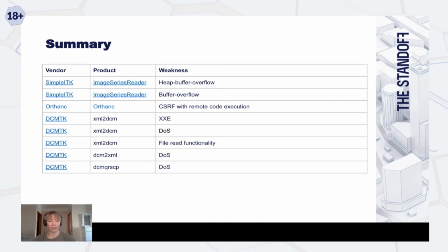And in the end of my presentation, I would like to make a summary. I would like to say that the DICOM protocol is used for medical imaging. It's one of the machine learning trends. But on its own, it operates with patients' personal data. And the question of security is still open. And some default configs of the DICOM servers allow almost anyone to get access to this data.